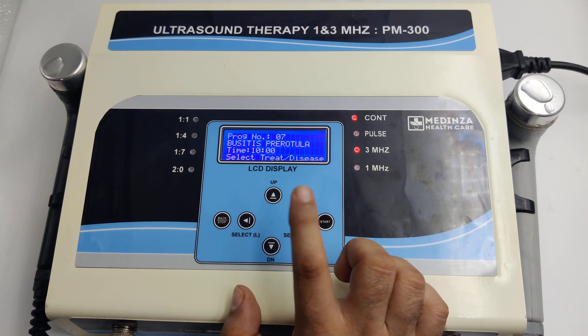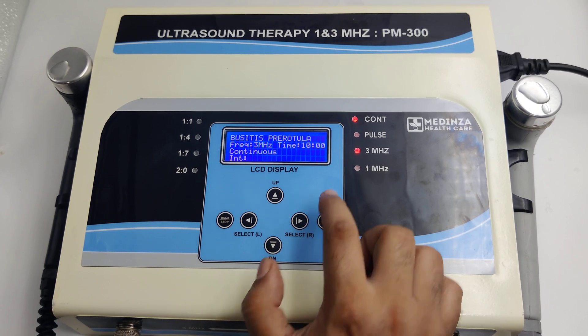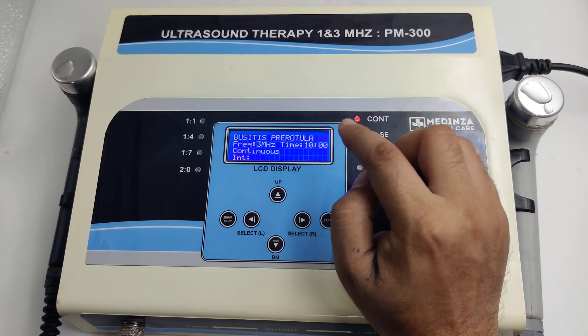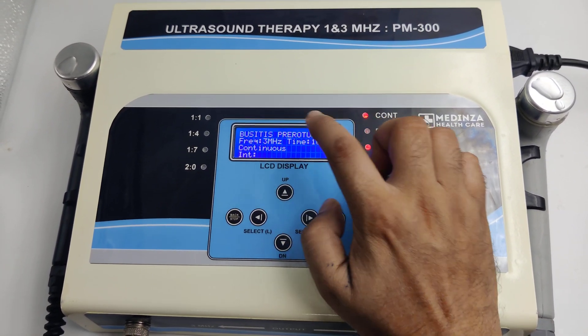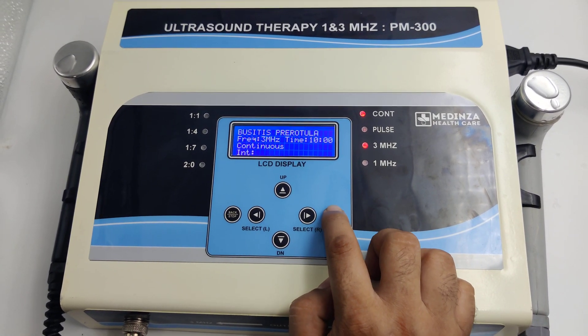If we are talking about program number 7, we can see the program name, frequency, timing, and mode displayed on screen.